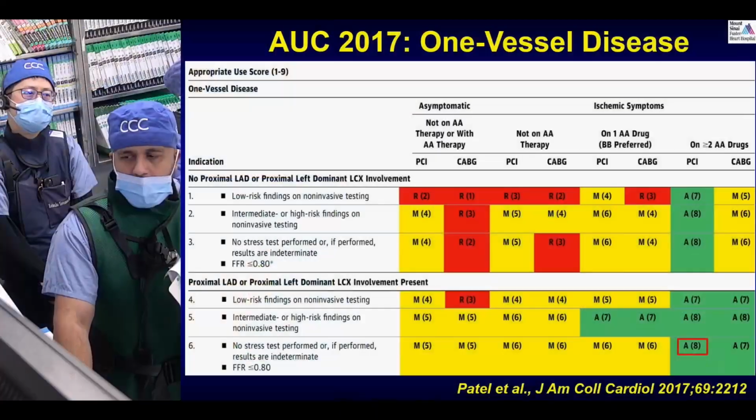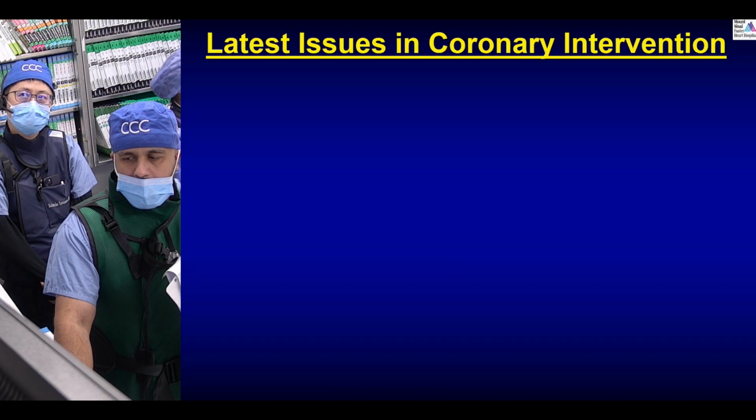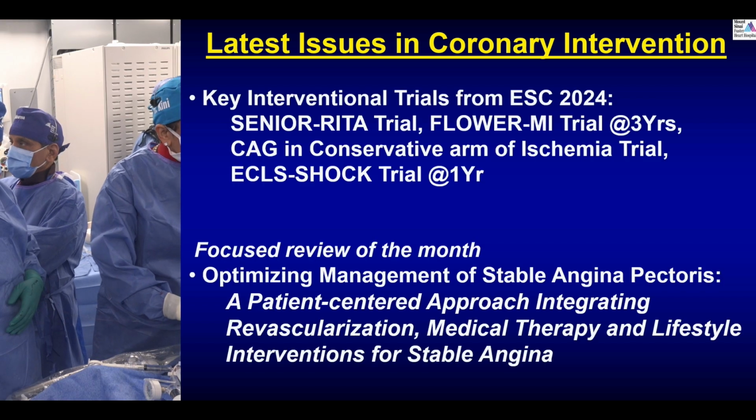You're in the diagonal wire. Yeah, give me a 2. We are in the LAD, but then there's a long balloon not making the thing. Get us, all right.